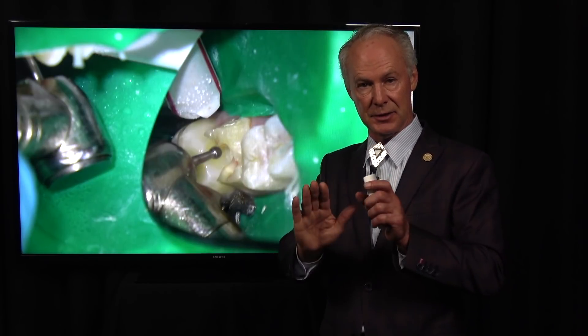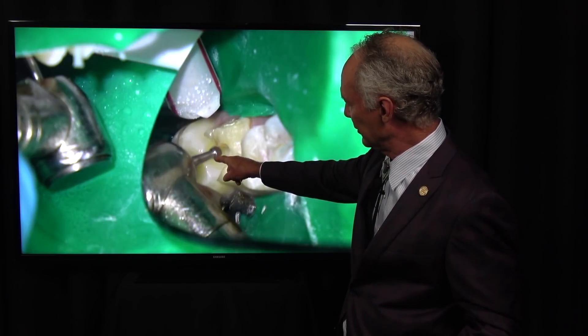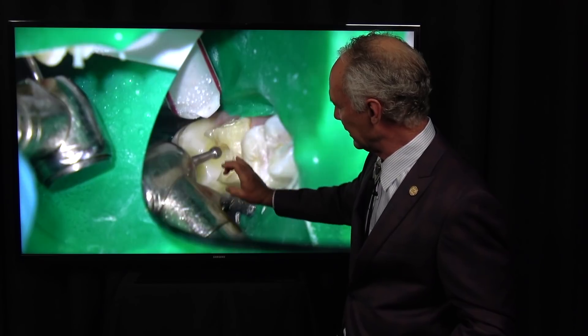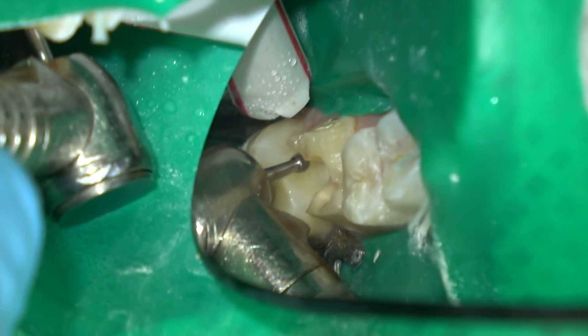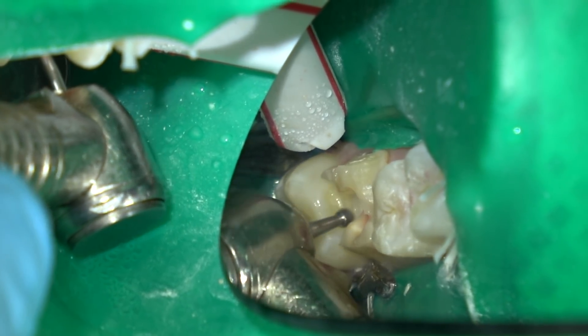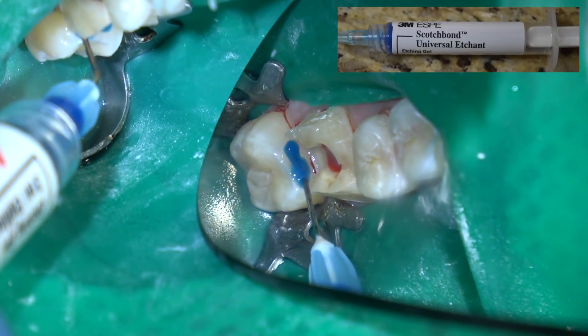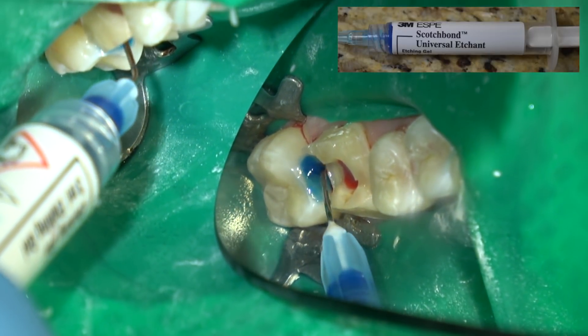A small composite filling is great because the coefficient of thermal expansion differential is not significant between a tooth and a composite at small sizes — but as they get big, it really becomes significant. So I place either processed inlays — my favorite is a gold inlay if it's just an MO and very conservative — or a crown. In this case we had mesial decay on the second molar, so I'm removing that decay and placing a very conservative composite filling there.